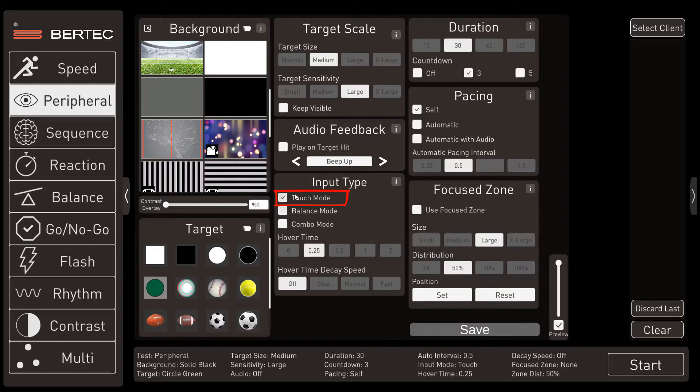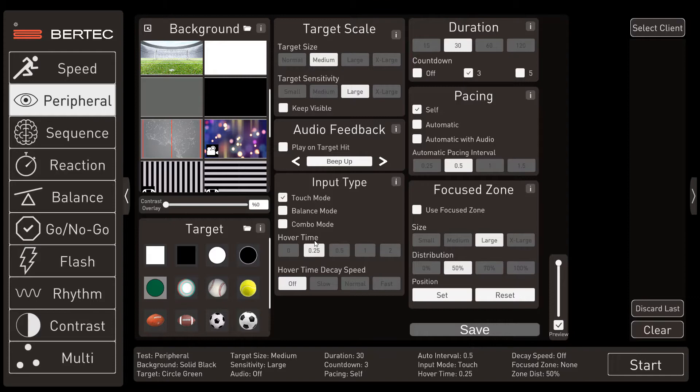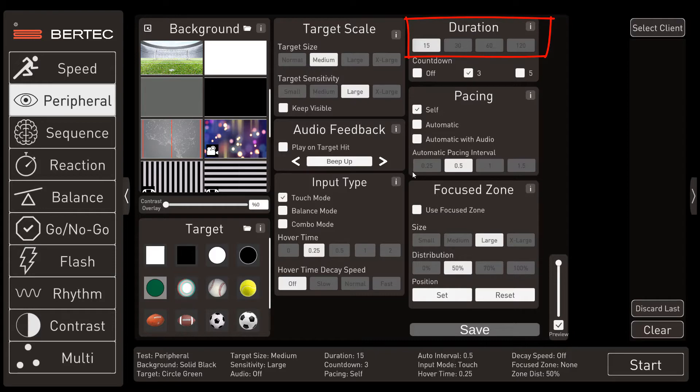But we're going to select target size to medium and the sensitivity to large. And for this demonstration, we're only going to use the touch mode. As they adapt and get better at this, then we can add balance and even combination. But you do need to be careful not to add too much too soon, because these are strong vestibular stimuli and could induce a fall risk. For this demonstration, we'll also set the time to 15 seconds instead of the normal 30.